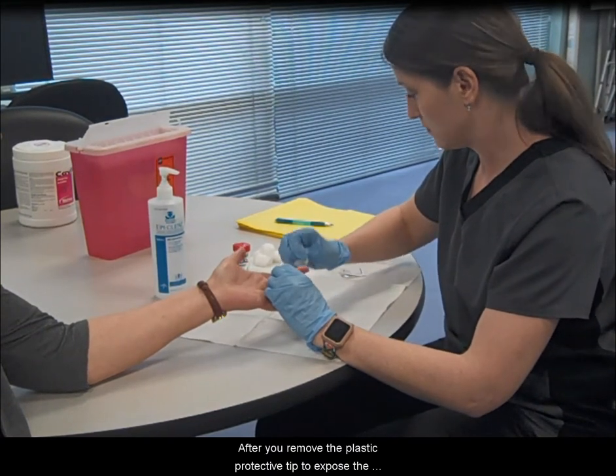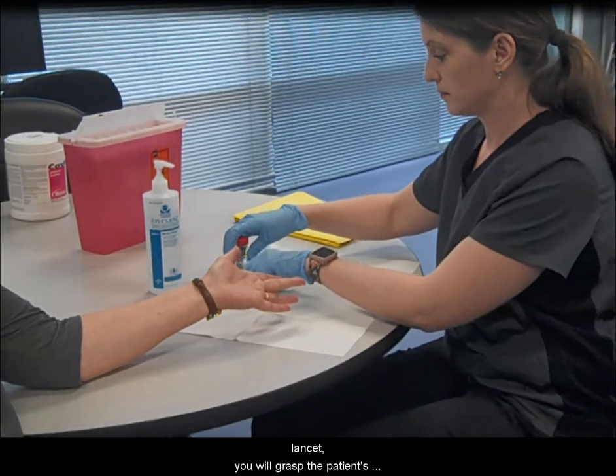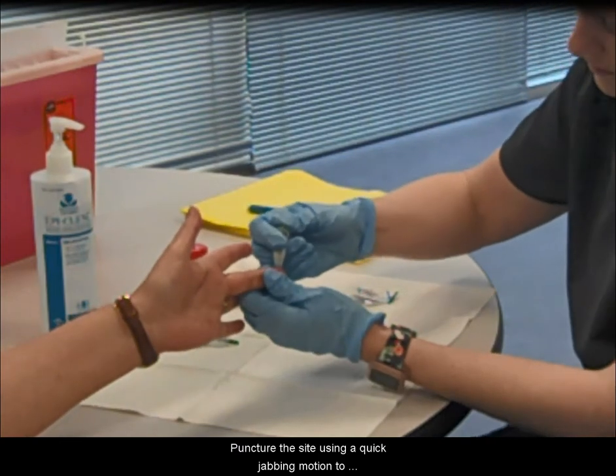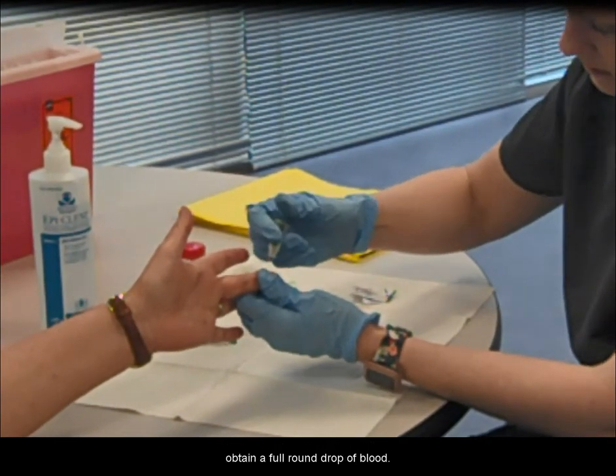After you remove the plastic protective tip to expose the lancet, grasp the patient's hand or infant's heel and gently squeeze one inch below the chosen puncture site. Puncture the site using a quick jabbing motion to obtain a full round drop of blood.